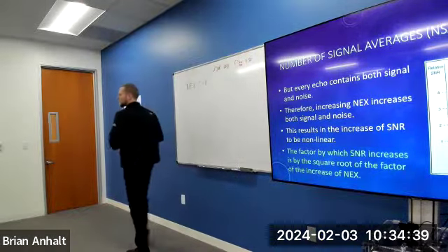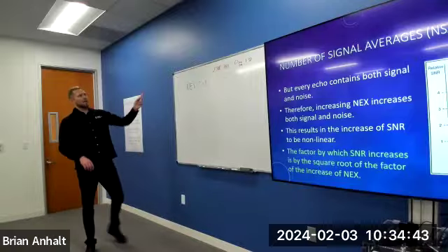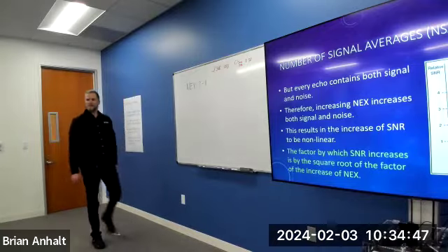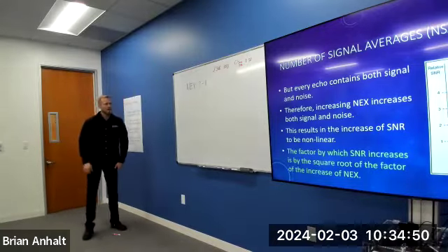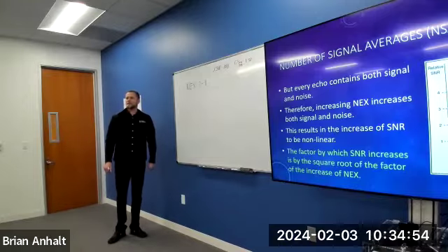All right, my first NEX was 2. With that NEX, my original SNR was 100 and my original scan time was 1 minute and 30 seconds. What happens to SNR and scan time if I increase my NEX from 2 to 8?